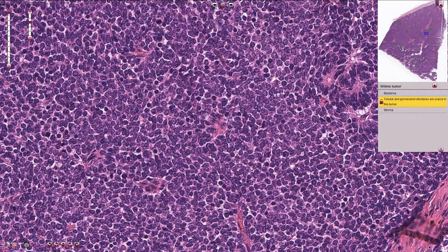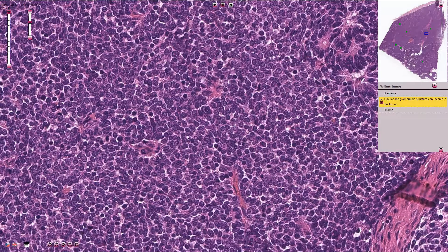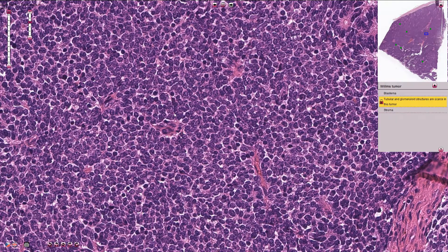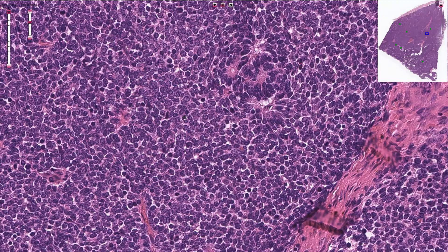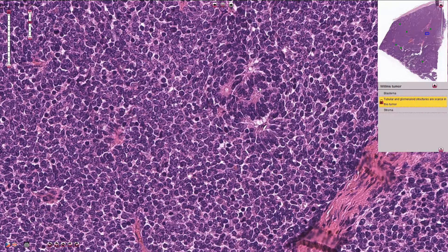They have hyperchromatic nuclei, dense chromatin, and we can see some mitotic figures. Then we can find some epithelial component, which is usually tubular and can form these rosette-like structures or slightly better differentiated tubules.